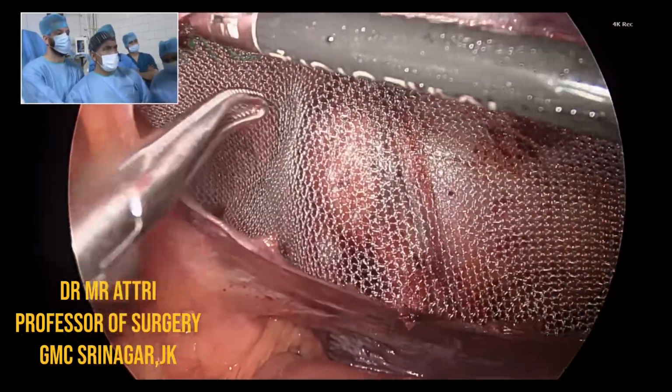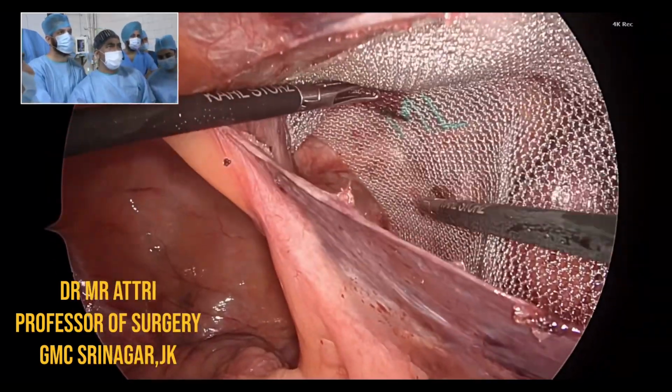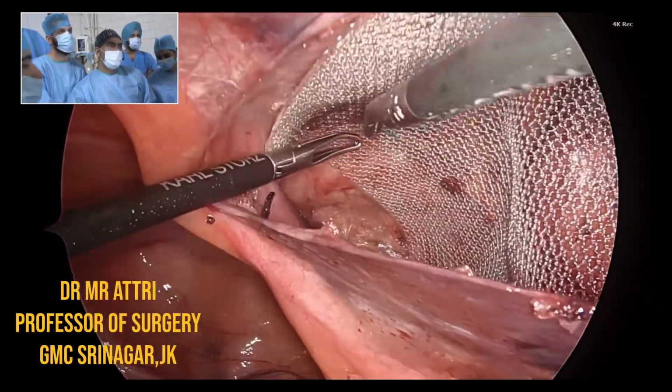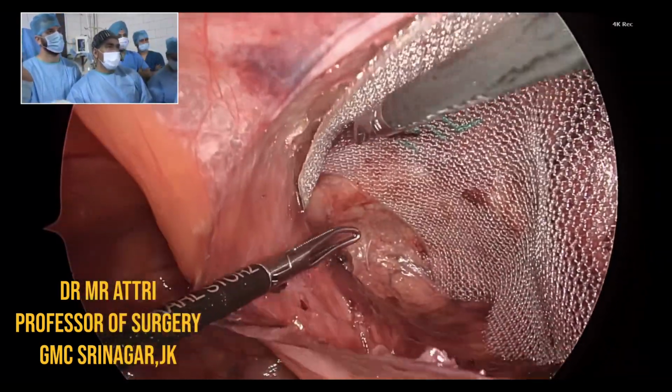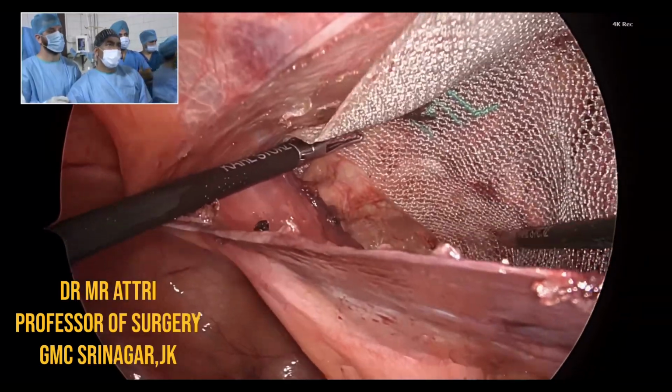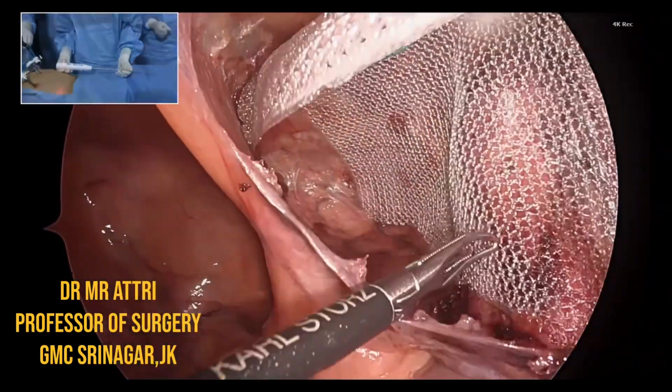Give me tacker. You can see this tacker has a definite indication of how many staples are there, how many you have fired, and this is an adapter operated tacker. So again and again I am focusing on the inferior margin of the mesh.